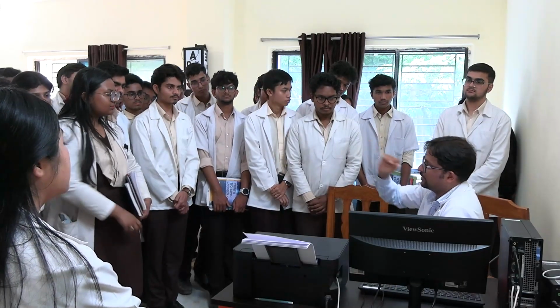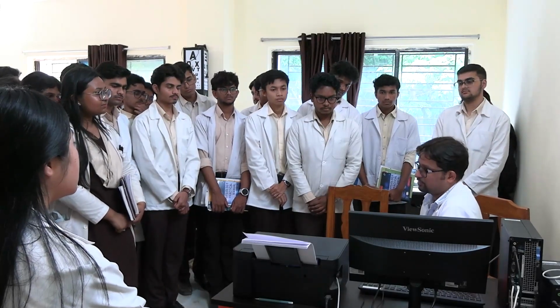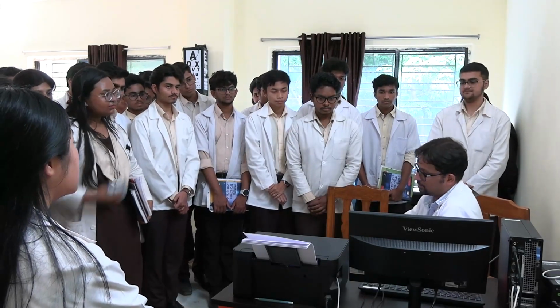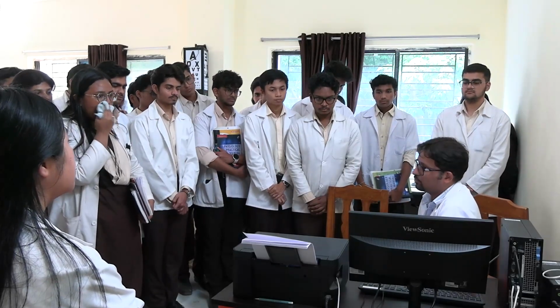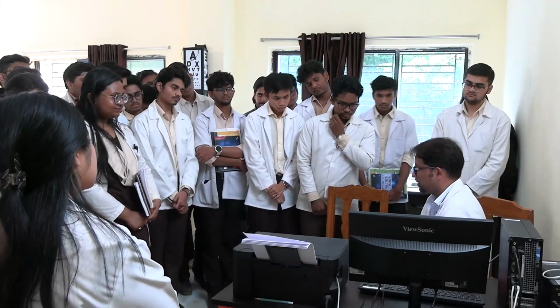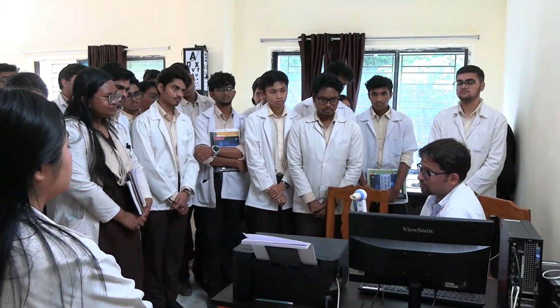So now you have had an exposure of how vital capacity is recorded. So that is a simple spirometer or a vitalograph, right? So in that setup, time component you cannot measure. But in sophisticated setups like this one, a digital spirometer, we have one pressure transducer here. So this transducer is actually within this part. So this is the body of the spirometer. So this spirometer, the model is RMS Helios 401.